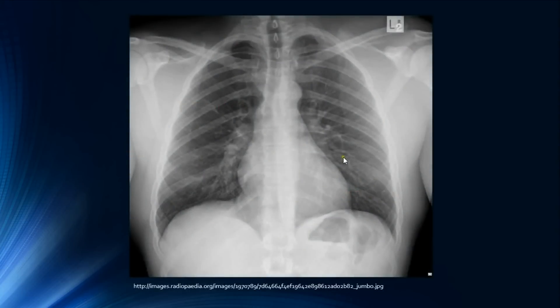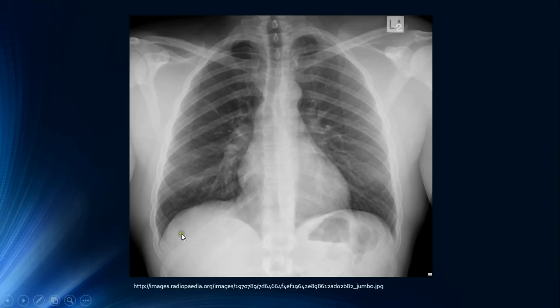Here we have a completely normal chest radiograph in the standard PA projection. We know it's a PA view because there is no label mentioned — so we assume it is PA, which is the standard — and also if you look at the scapulae, they are projected over the lateral aspects of the lungs, confirming this is a PA view.